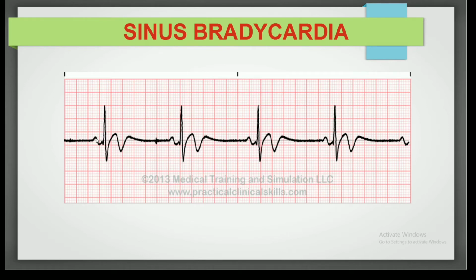Then the sinus bradycardia. In sinus bradycardia, the electrical impulses are generated from the SA node and transmitted through the AV node. This is a normal and rhythmic wave, but in the SA node, the action potential generation is delayed, or the electrical impulses generated in the SA node are delayed and decreased. So the heartbeat is delayed. 1, 2, 3, 4, 5. This is 5 P waves. It means 50, less than 60. In a normal adult this is called bradycardia, but it is a sinus rhythm.